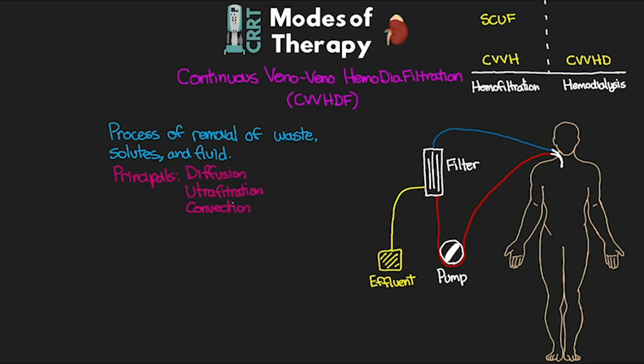Now, one thing I didn't specifically mention in any of these modes here is the principle of adsorption, and that is actually going to be present for all of the modes that we do. Again, really just kind of dependent on the filter type that you're using. If it has more adsorptive properties, then we're going to see those benefits in the therapy. So now let's go ahead and add this mode to our chart here, and as you can see, this one actually uses both hemofiltration as well as hemodialysis, so we're going to have this one straddling the middle of our chart.